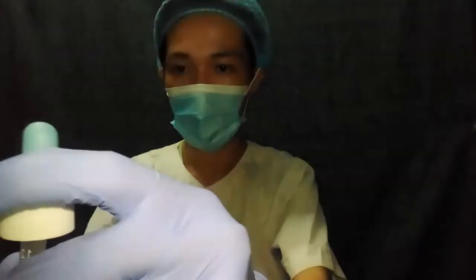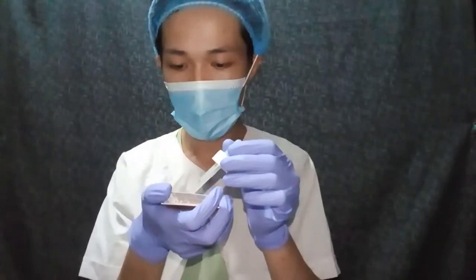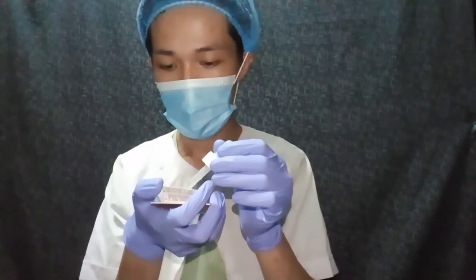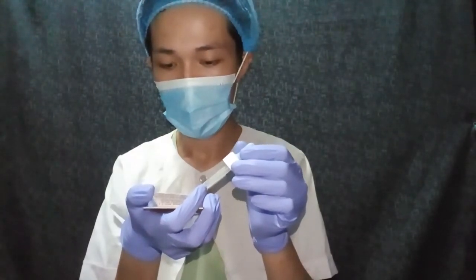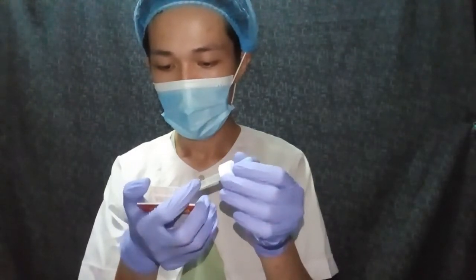I'm just going to get some developer. There we go. I'm going to put two drops of the developer over each smear and then one drop on the control.